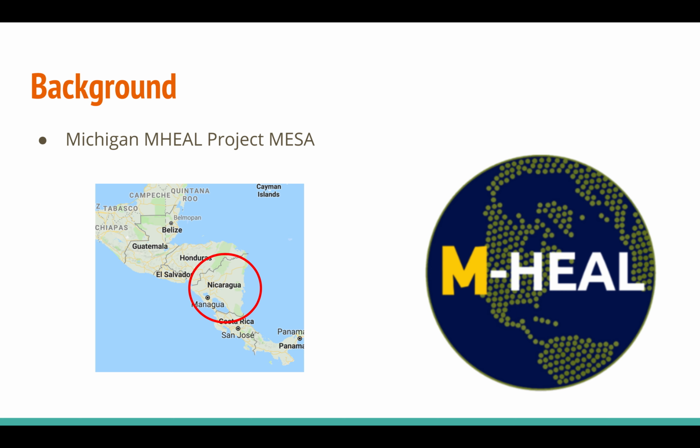As a little bit of background, Project Mesa, which Cameron and I are both active design team members of, is an MHEAL team at Michigan that works to produce a low-budget portable gynecological exam table to service rural villages in Nicaragua. The need for this product originated from the observation that cervical cancer death rates are very high in Nicaragua, despite cervical cancer being highly treatable if discovered early.